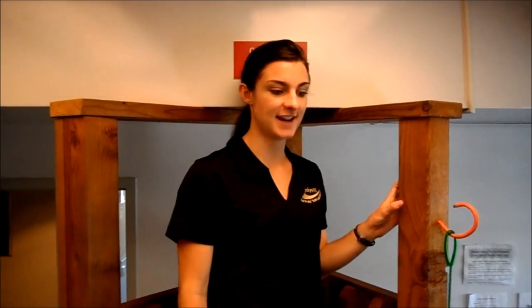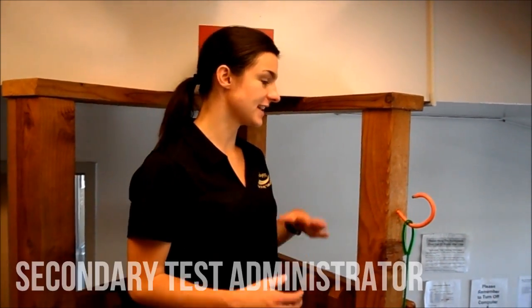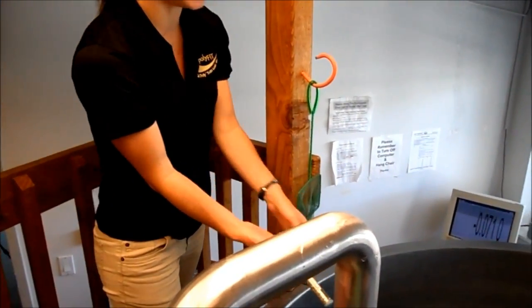The next test we're going to do is called Hydrostatic Weighing. Your secondary test administrators will need to check the temperature of the water in degrees Celsius using the thermometer located on the side of the tank.